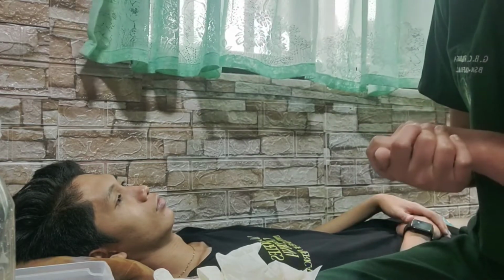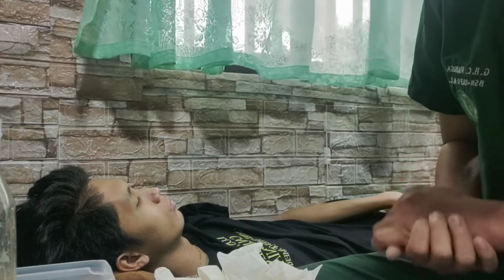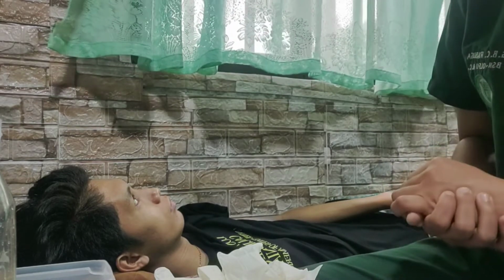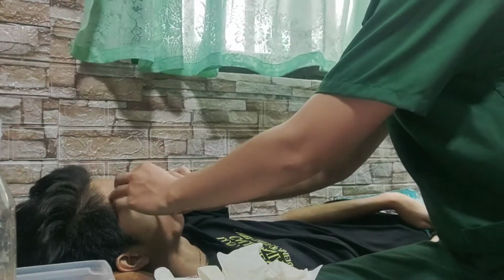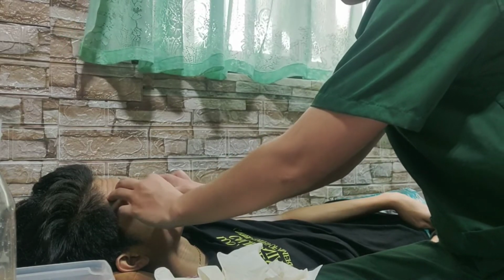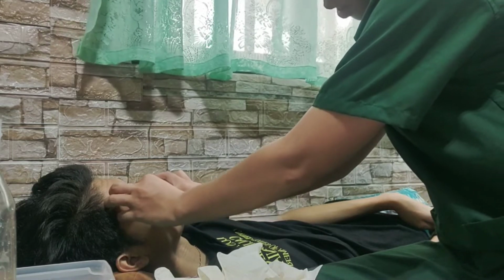So let's start. So gently pull down the lower eyelid with one finger. Then, instruct the patient to look up and slide the lens down. And gently pinch the lens between the thumb and index finger. So, sir, please look up. I'll slide down the contact lens. Pinch the contact lens.